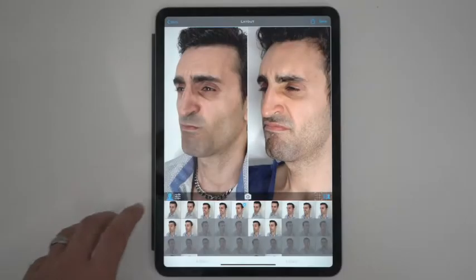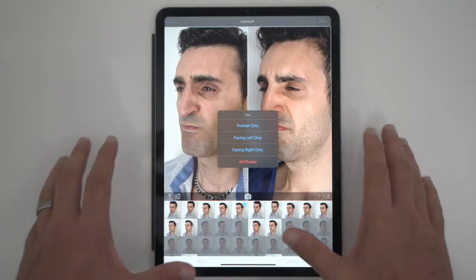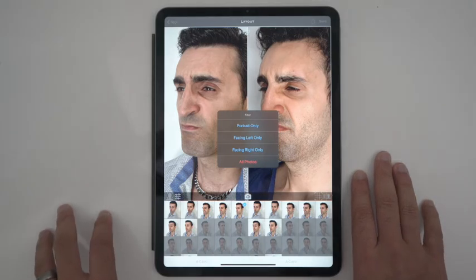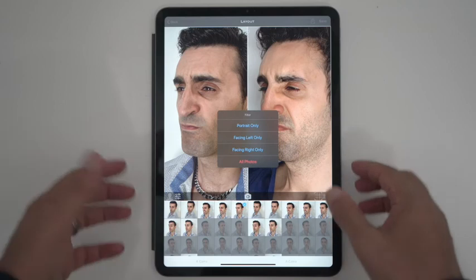So that was Treatment Pad 1.4.0. Face orientation filtering is now ready and live. In the next version, we're going to be expanding on this functionality and introducing video animations, so stay tuned for that.